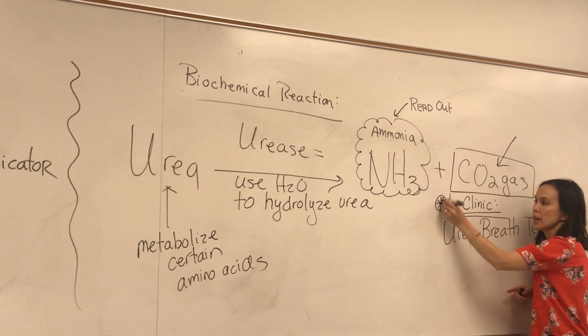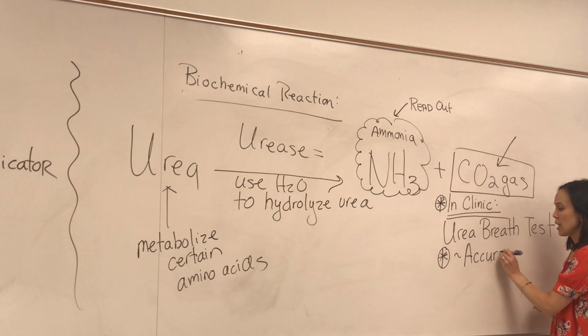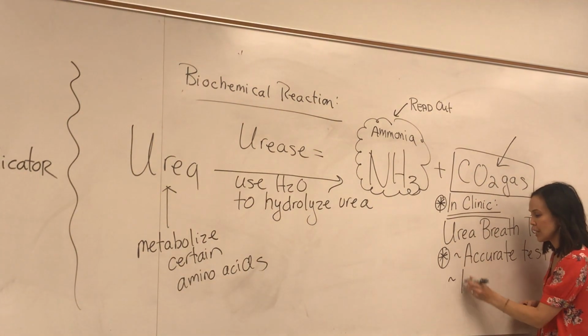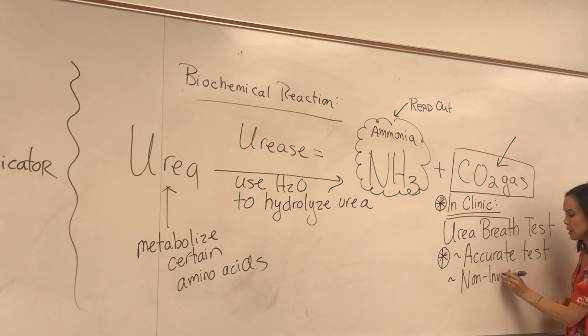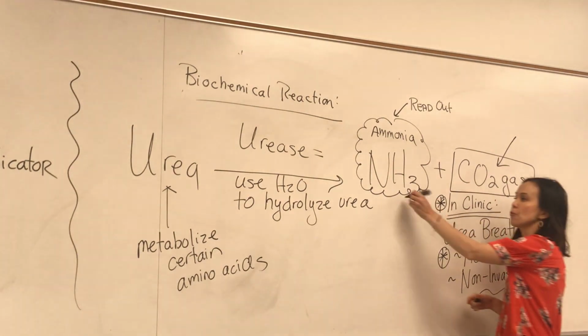And it actually is a pretty accurate test. What's really nice about this test is it's totally non-invasive. You just breathe out into the machine. It's not like a surgical procedure. It's very quick and very easy. I had a student in the morning class who said that's what they did to her. What's nice is you can do the breath test before treatment, and then you can do it after treatment and see if the treatment worked. But anyways, for this lab, we're going to look for ammonia.